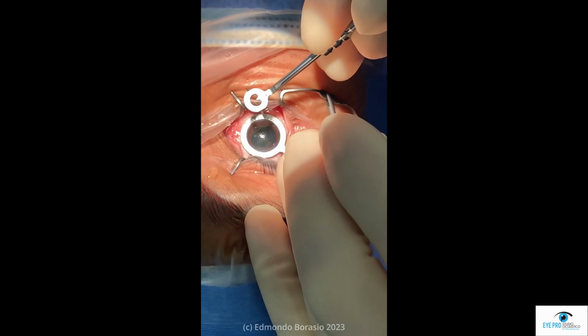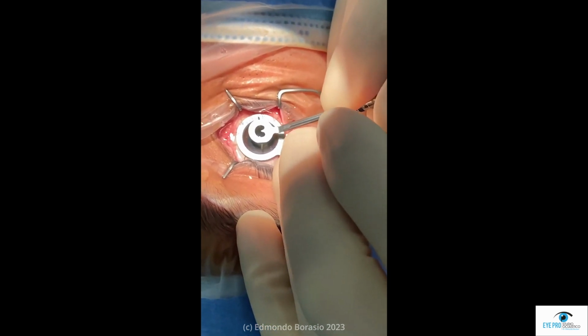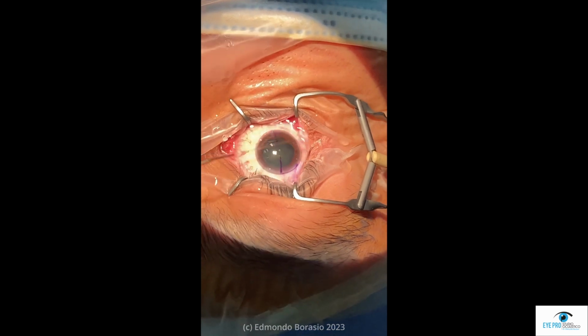The easiest way to mark the implantation axis is by aligning the 0 degrees position on the toric gauge to the dot present on the limbus, and then counting clockwise or counterclockwise the degrees of offset required.